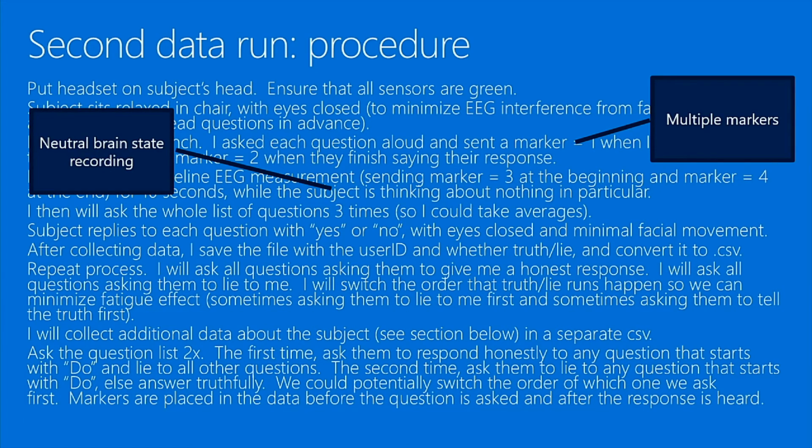I'm taking a neutral brain state recording. Remember when I was training to pull the cube with my mind, I needed to provide that neutral brain state. So their algorithm is obviously using that. And the more I think about it, just to normalize the data well, having a neutral brain state matters, because my brain might spike at 8, and Mark Racinovich's brain might spike at 24. So we just don't know. The neutral recording might help with data normalization so it works well across all users.